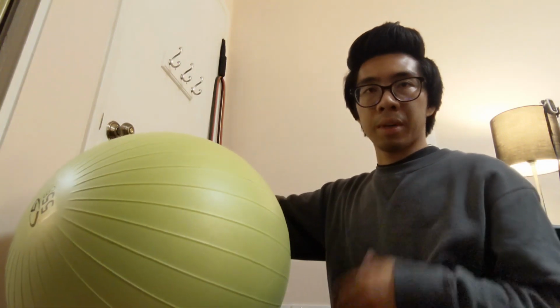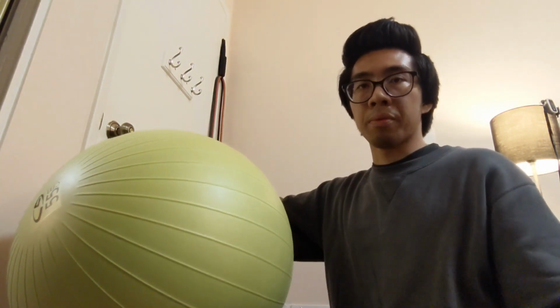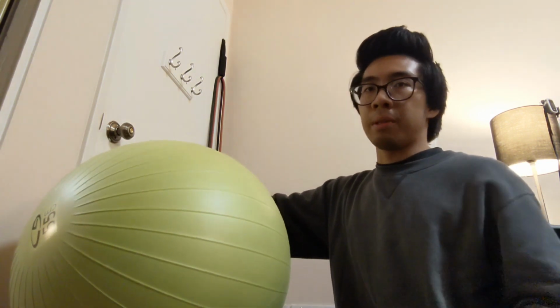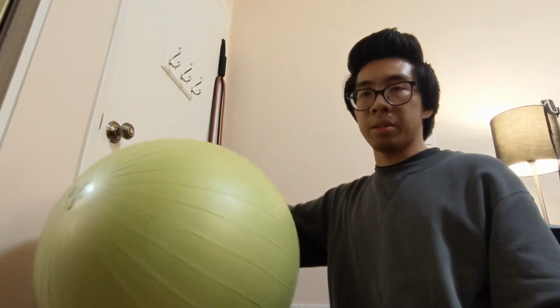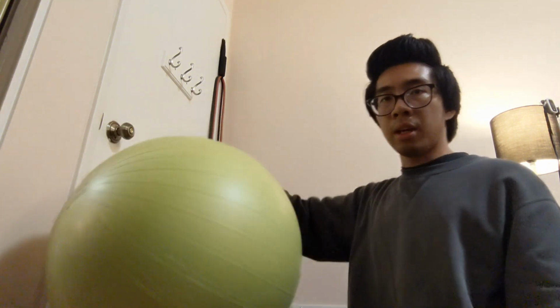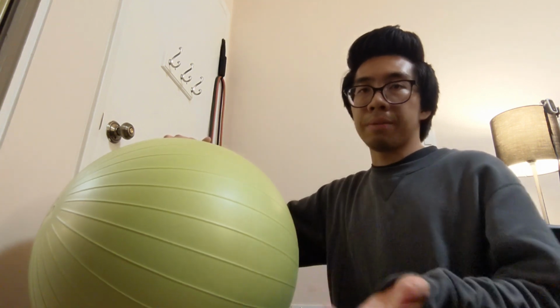For my positioning devices, I'm going to be talking about the therapy ball and the bolster since I'll be using them both for my intervention. So with the therapy ball, it's very multi-purpose. It can provide the vestibular and proprioceptive input as kids are swaying and rocking back and forth, side to side, when they are either sitting on it, laying prone, or even supine.